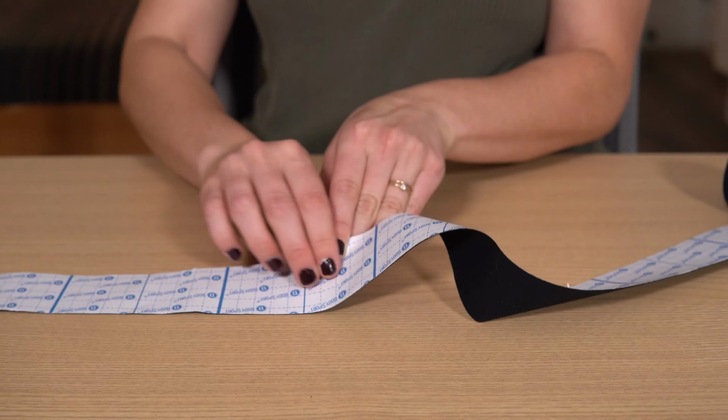And then from there, you are going to take your scissors and round the corners of your pieces of Kinesio tape on both sides. And this is just so you don't get any corners or hard edges. Even though the tape is soft, you don't want it to bother your skin or irritate your skin. And sometimes those hard edges will peel up more easily than the rounded corners. So you can see it's not perfect. It doesn't have to be perfect, just do your best.